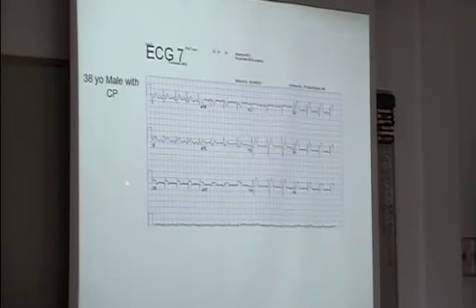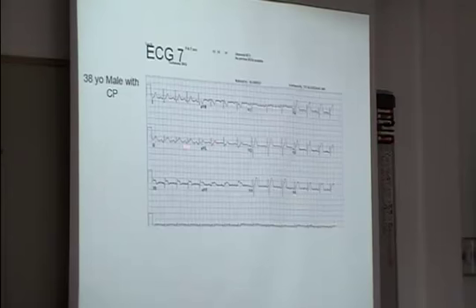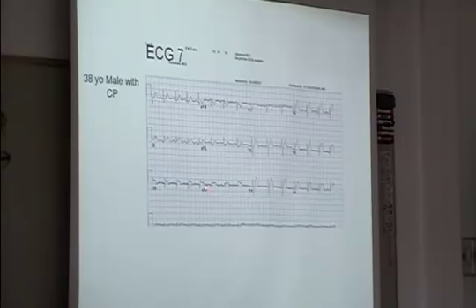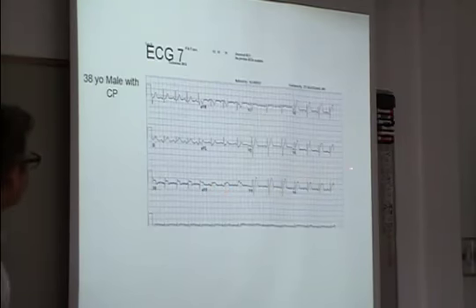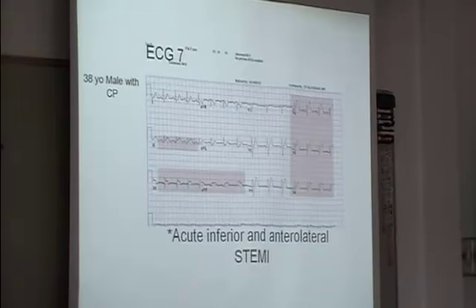38-year-old man with chest pain. We see leads 2, 3, and F are elevated, so you think about acute inferior MI, although I'm a little worried about this PR depression down here. I'm wondering if this is acute pericarditis. It looks like it's fairly diffuse — that's the elevation throughout.